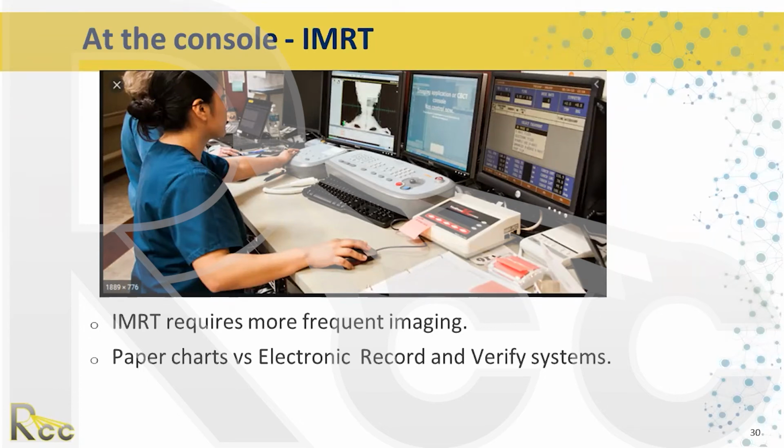And then this just says we want to make sure that the MLCs are moving. On this screen, you can see up here the MLCs. If you're doing IMRT, you want to make sure that those are actually moving during treatment and drawn in. One therapist could be making sure the MLCs are moving, maybe looking back and forth at the patient, but the second therapist should also be checking: are the MLCs in? Is the patient being still? Do they need us for anything?